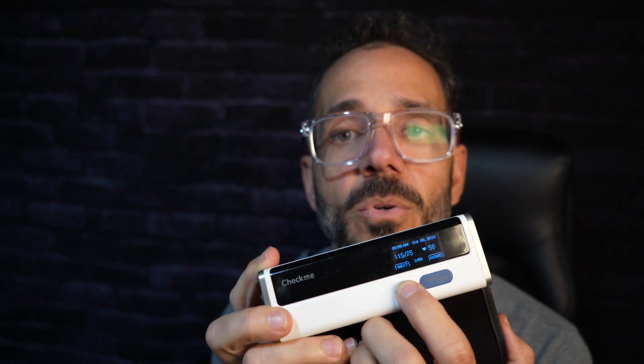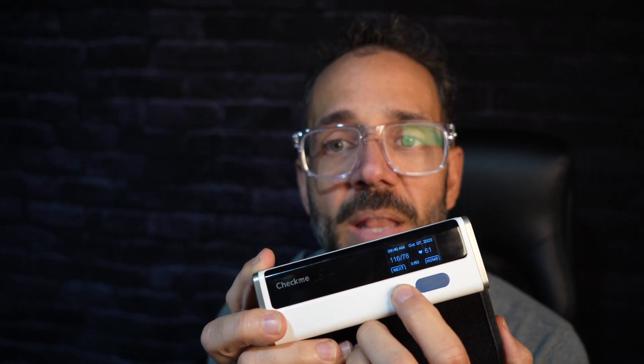Now I check my blood pressure almost every day. The cool thing about this is it will save all your blood pressure readings. With the press of a button you can bring up your last sets of readings and the dates.